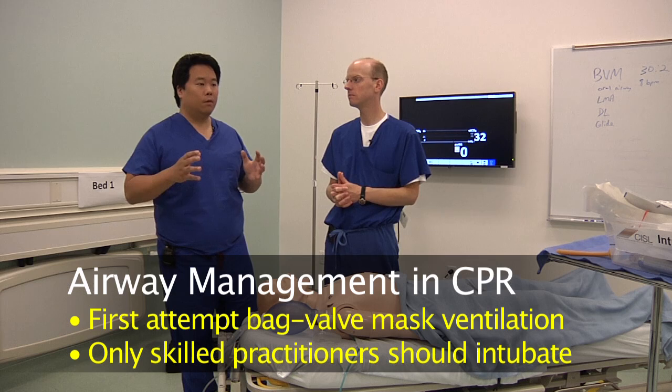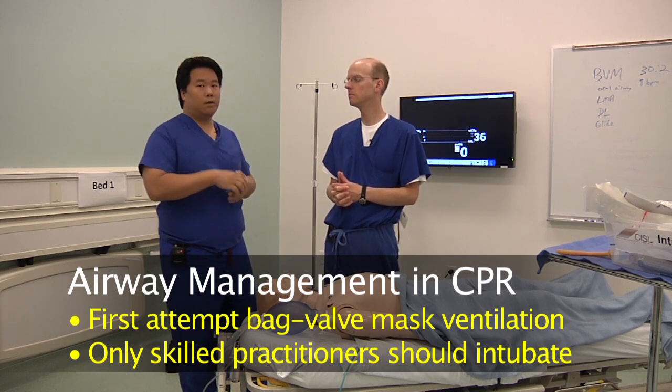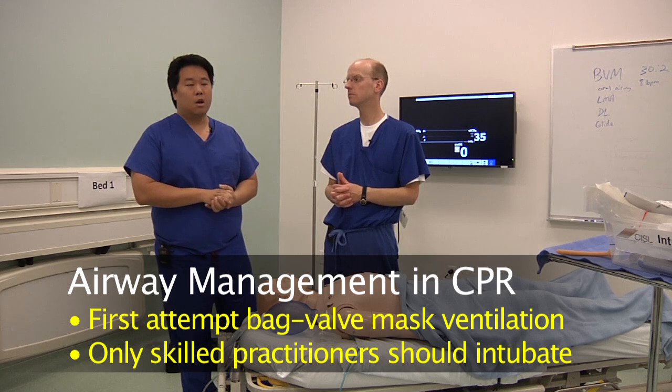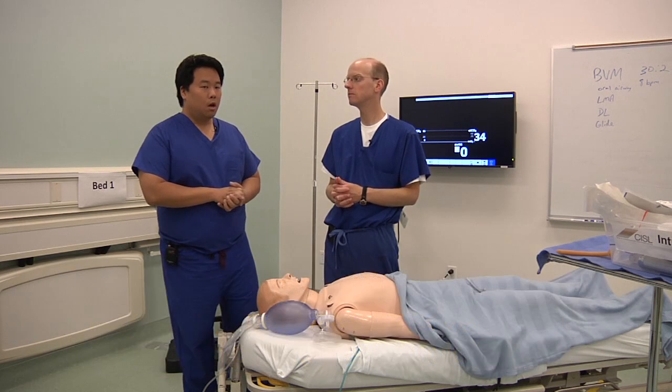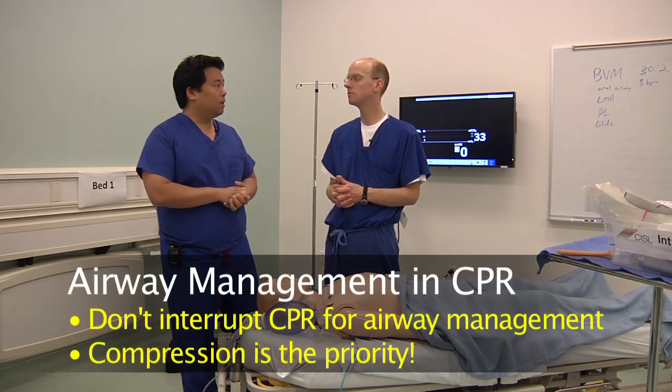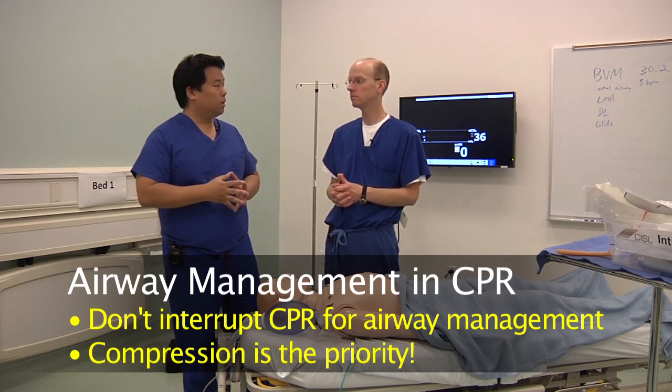Now, however, if you are somebody who does endotracheal intubation on a routine basis, if you're an anesthesiologist or another physician who's comfortable with performing endotracheal intubation, it may be reasonable to attempt endotracheal intubation between compressions, but certainly don't hold chest compressions.